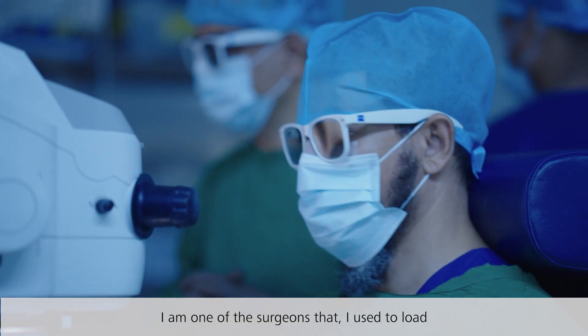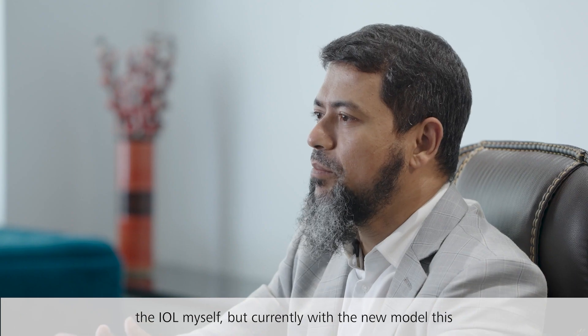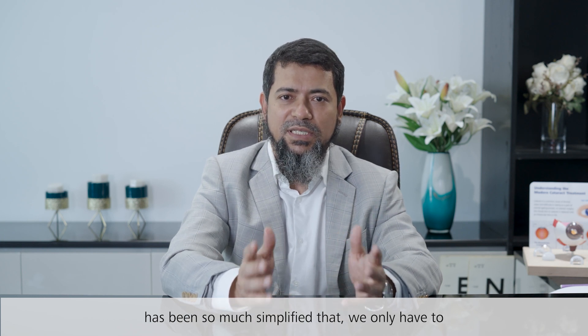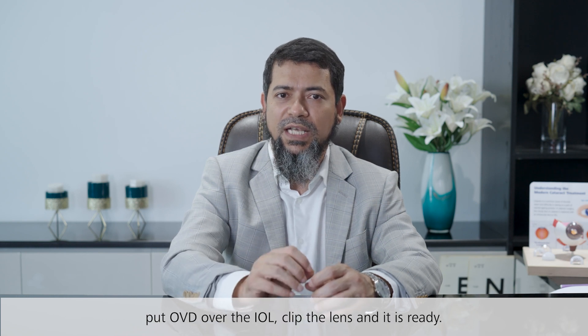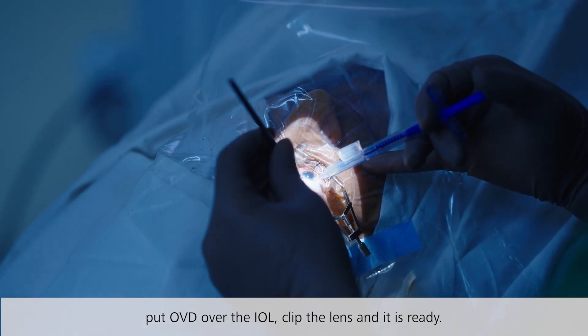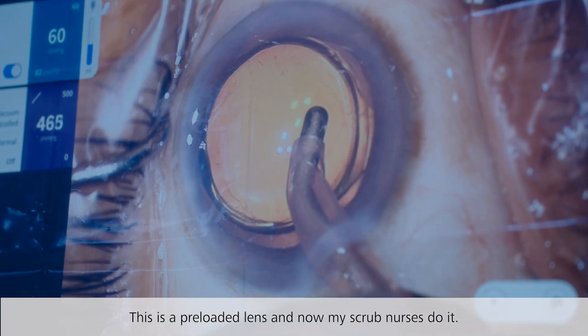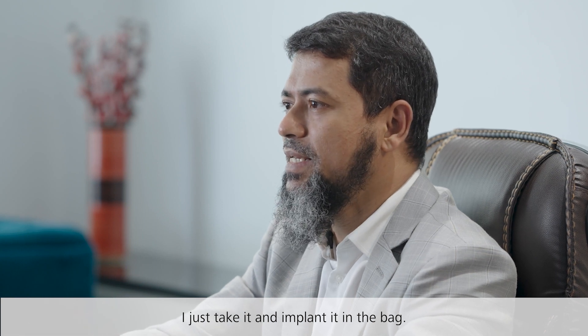I am one of the surgeons who used to load the IOL myself, but currently with the new model this has been so much simplified that we only have to put OVD over the IOL, clip the lens, and it is ready. This is a pre-loaded lens and now my scrub nurses do it — I just take it and implant it.